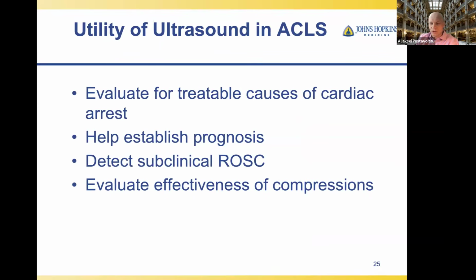As we mentioned, if it's a pseudo-PEA, it's a better prognosis. The latest recommendation, if you see it's a cardiac standstill, you cannot just say, hey, we cannot do anything. You just have to realize that the prognosis may be worse than otherwise, but you should not make decisions about chest compressions purely based on the standstill.